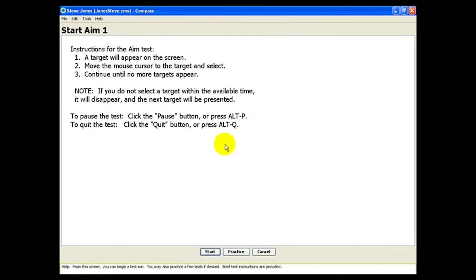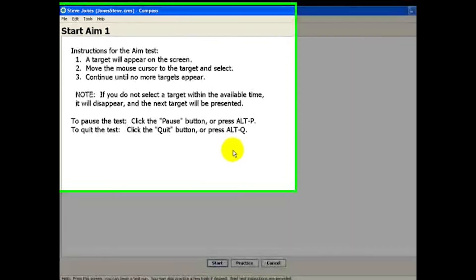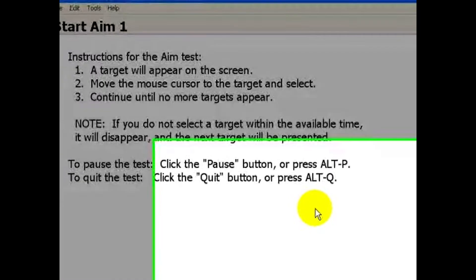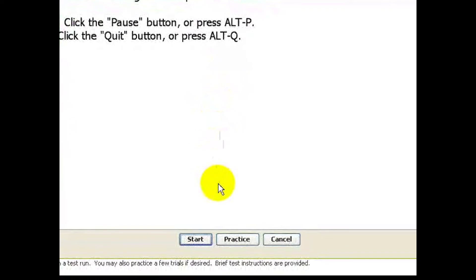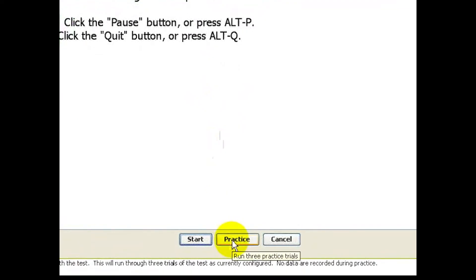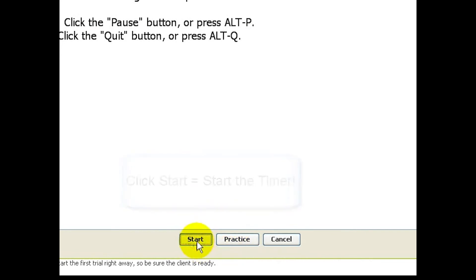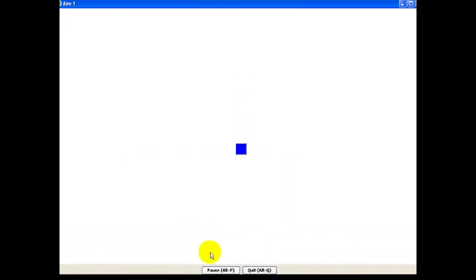This Start screen provides some basic instructions, which you can go over with Steve. It also allows Steve to practice, which can be a good idea if he's never done the test before. When you and Steve are ready, click Start to begin the test.